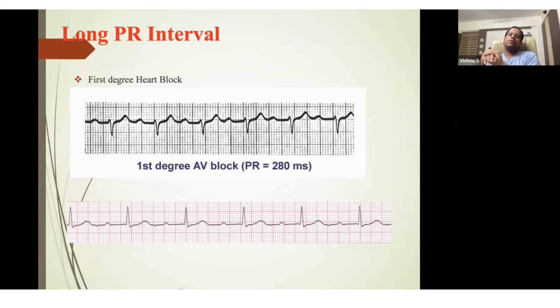So an asymptomatic patient who is having first degree AV block in a rhythm strip usually does not imply any disease per se. But heart rate lowering drugs, if they are there, should be modified if indicated. Usually, if the patient is on long-term beta blockers, they have first degree AV block without any problems. If the beta blocker is indicated for that patient, there is no harm in continuing the medication. But this can always be a harbinger of high grade AV block later.